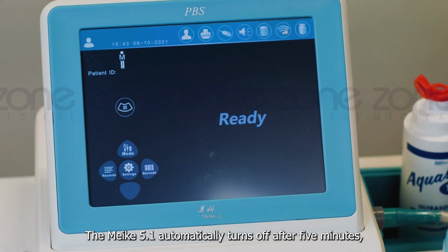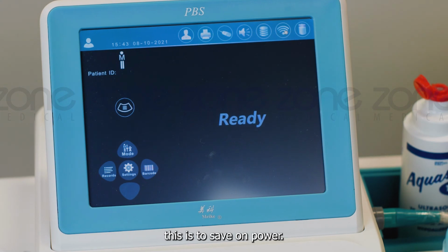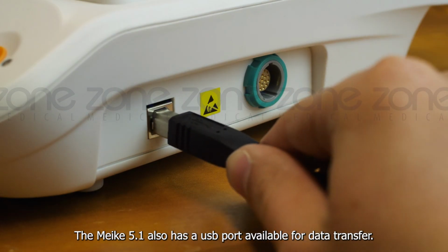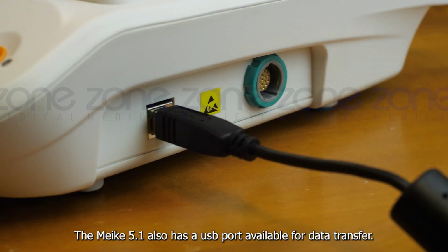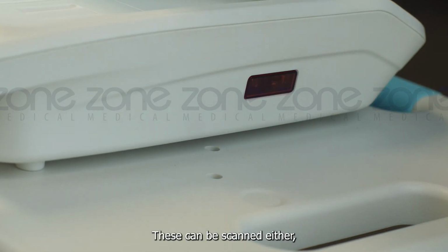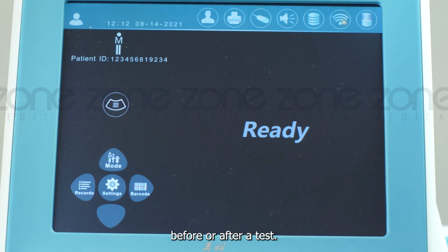The Meike 5.1 automatically turns off after 5 minutes. This is to save on power. The batteries can be charged within the scanner or via the battery charger supplied. The Meike 5.1 also has a USB port available for data transfer. The Meike is also able to scan barcodes. These can be scanned either before or after a test.